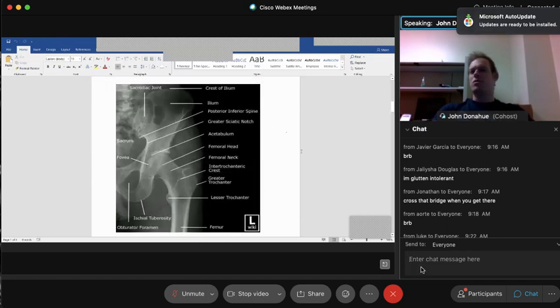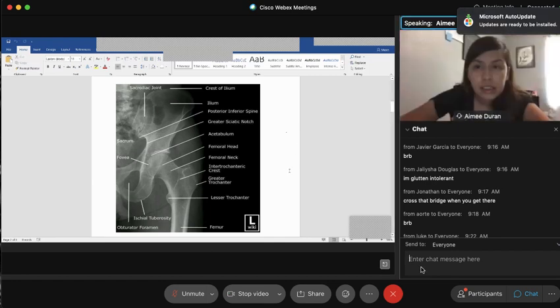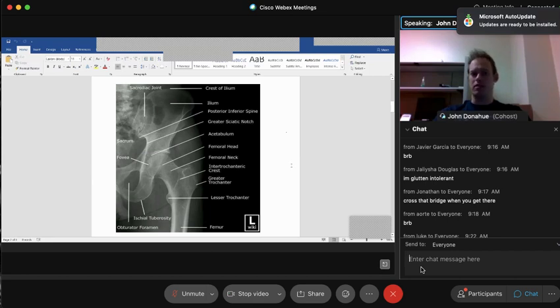All right, what is that one? Someone tell me. Is that the left unilateral frog leg? So it's not a frog leg. You're right about it being a unilateral. It's going to be an AP unilateral hip or unilateral AP hip. So the lateral hip is actually going to look a lot different than that. I believe I have one on here to show you the difference. So same thing, guys. All this anatomy is very important. So all this anatomy on this x-ray.